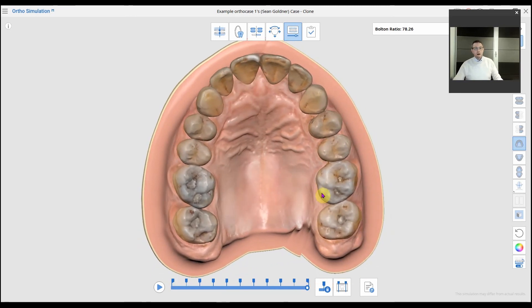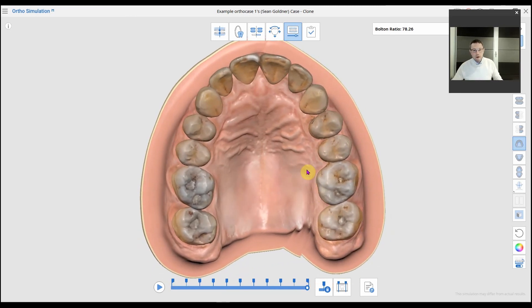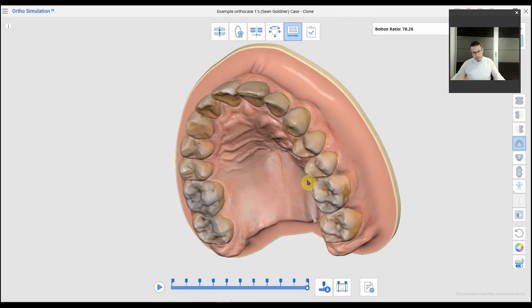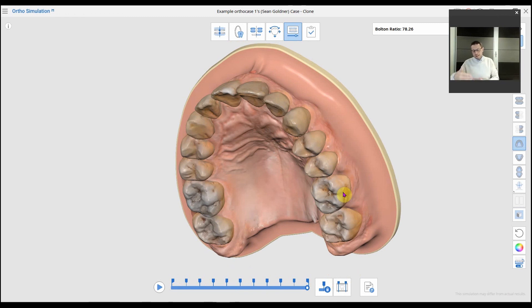You can split this into a number of different stages — I've set it to 10 — and export each 3D model as an STL file. You can send this to the patient's mobile phone as a link. With Medit, all of the software is included with the scanner for free, subscription-free. You don't even need to purchase the scanner — you can install the software and use example patient scan data to play around with.